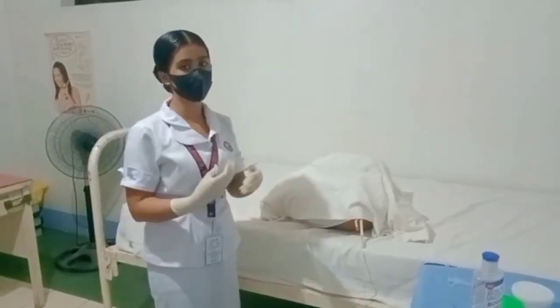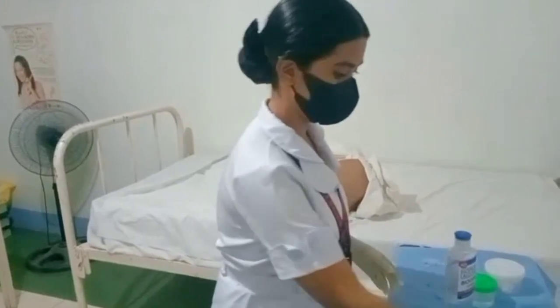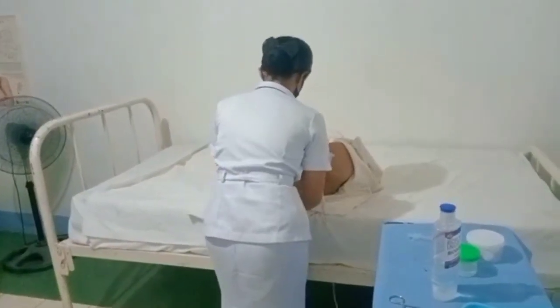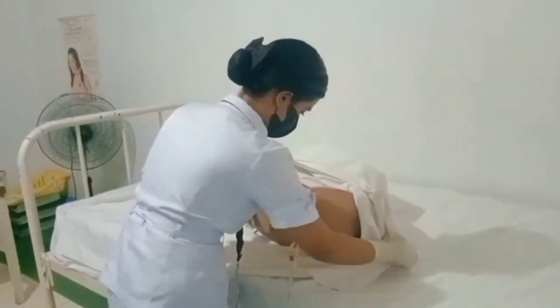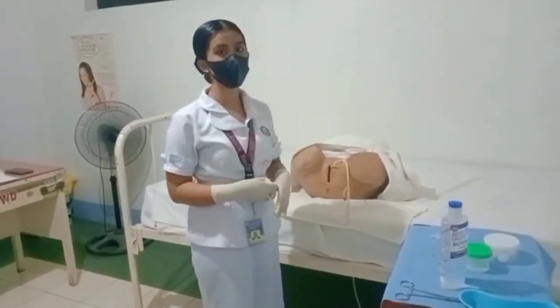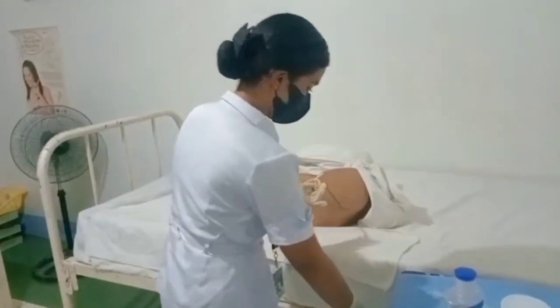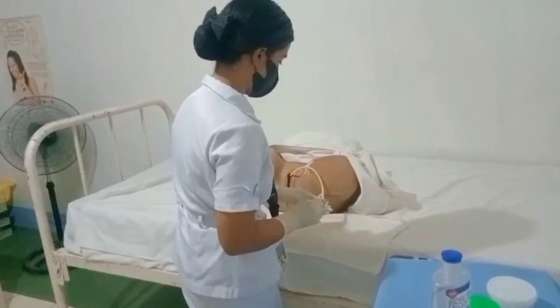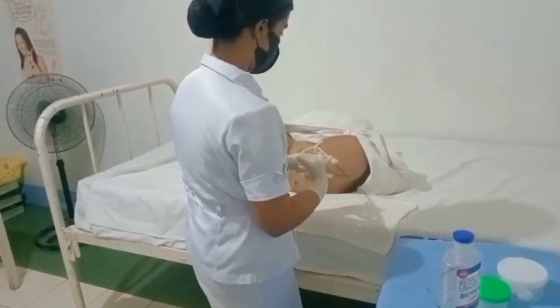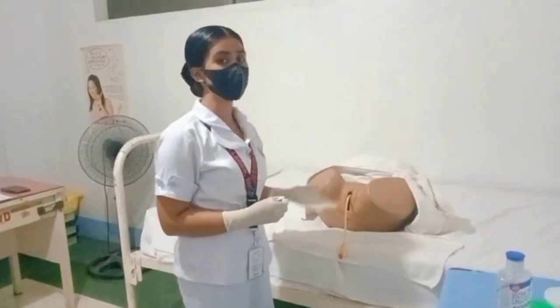I will place the protective pad under the patient's buttocks. I will drain urine from the tubing into the catheter bag. Give a report.